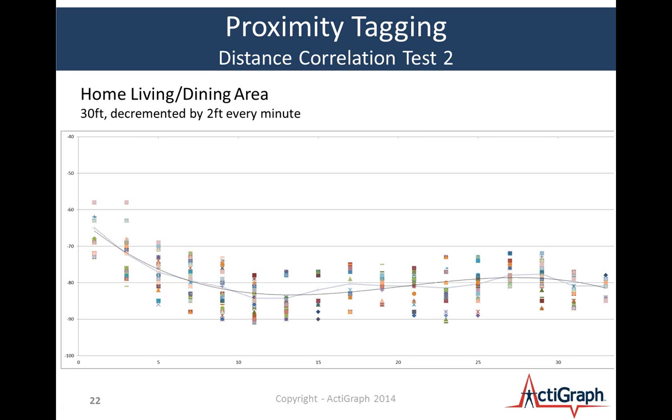And so you can see the challenge in trying to use RSSI alone to determine the distance between receivers and beacons. One great example: if I'm standing right in front of a receiver device and right in front of a beacon device, and I'm wearing a receiver, if I simply turn my body such that the receiver antenna has to receive a signal through my body, I immediately expect a degradation in that RSSI power indicator. So it's hard to determine these distances with just signal strength, and that's why we claim it to be a discrete yes or no.